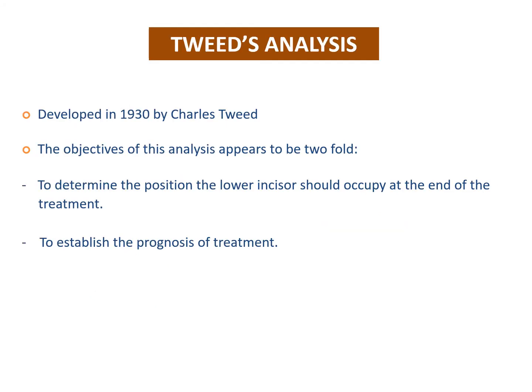We will now discuss the second analysis, which is Tweed's, which was developed by Charles Tweed in 1930. The objectives of this analysis are to determine the position the lower incisor should occupy at the end of the treatment, and also to establish the prognosis of treatment. So basically this analysis will help you to identify which position the lower incisor should take at the end of the treatment.